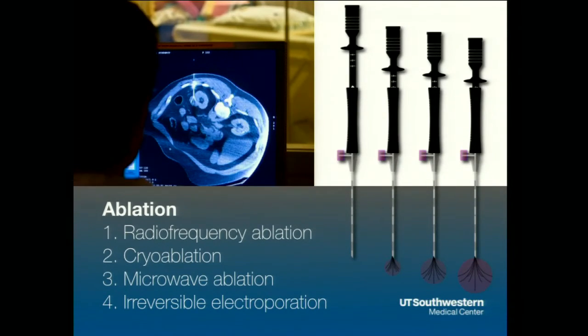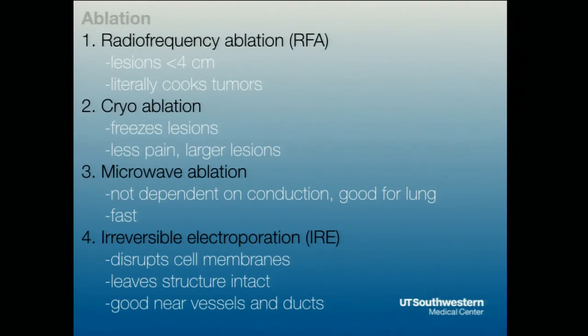Radiofrequency ablation is something that we've been doing for years. It's really good for tumors less than 3.5 or 4 centimeters. Cryoablation is freezing tumors, and microwave ablation is basically putting energy in, so it's tuned to the moment of vibration of a water molecule, same as the microwave in your house. And IRE is a new technique. These are all used for different areas.